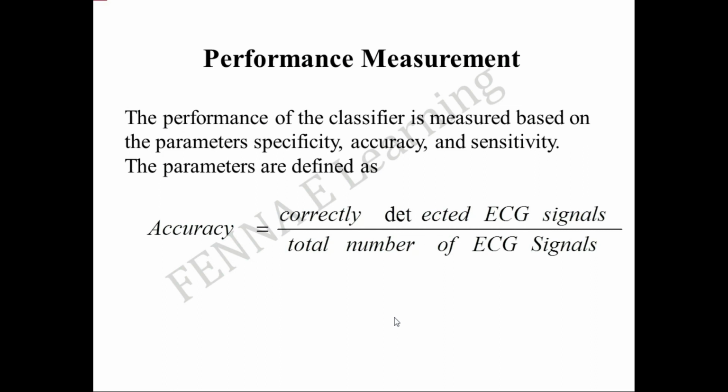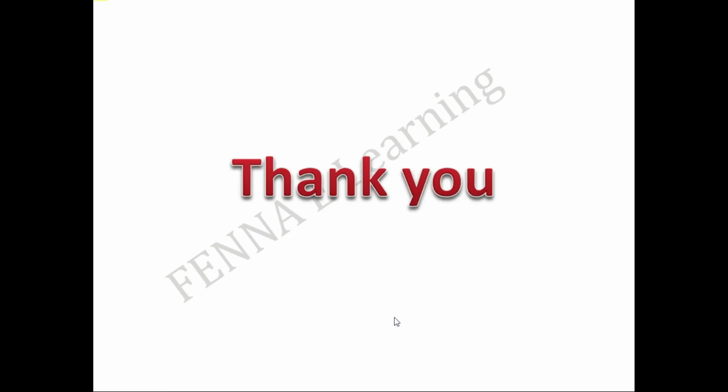The performance of this project work is measured based on specificity, accuracy, and sensitivity. The accuracy parameter is defined as the ratio of correctly detected ECG signals to the total number of ECG signals.